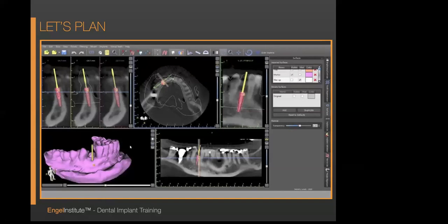Holding down the guide on number 29, drilling, placing the implant in. Of course, you're going to get torque. You have bicortical stabilization. You went through the lingual cortical plate. Guides need not rock. Okay, so I'm going to talk a little bit about the pitfalls of rocking, etc. But you have to have a guide that's in place with passive pressure all the way around by you and your assistant, and nothing should rock. Squishing is okay.